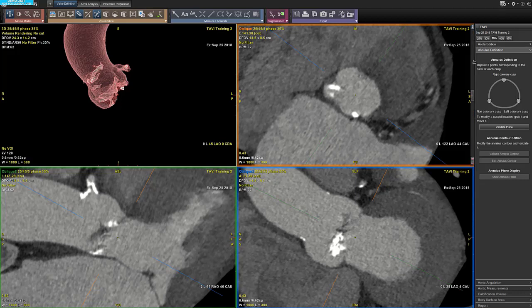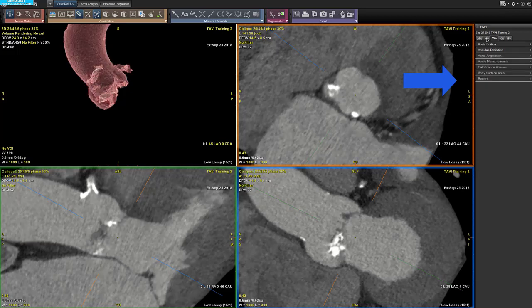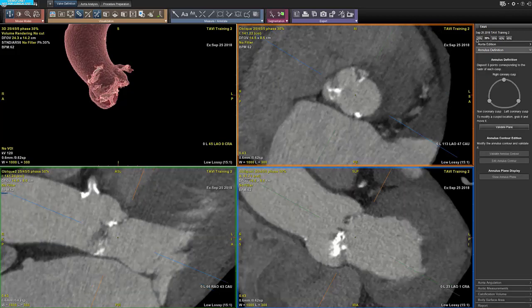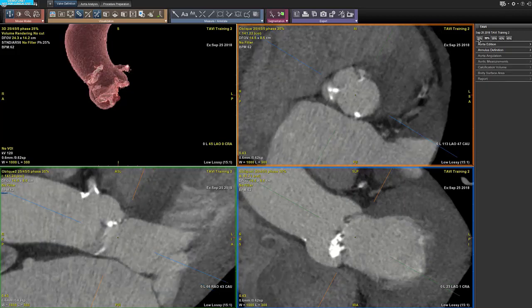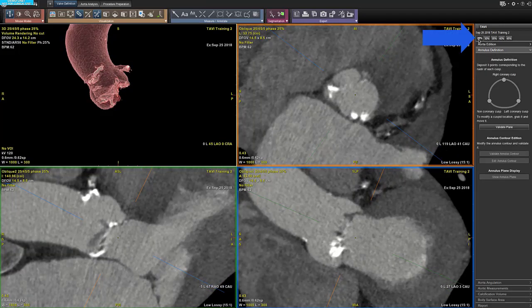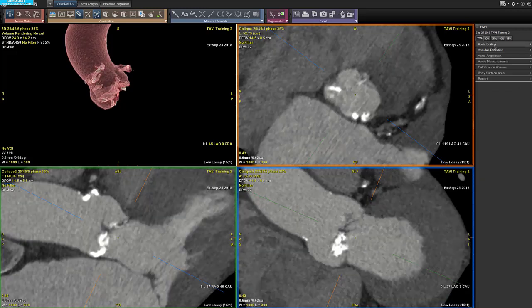Within the valve definition step, all the steps are displayed in accordion on the wizard panel on the right hand side of the screen. The first step is at the top and the following ones at the bottom. On the wizard panel, there are tabs for each phase. You can easily navigate from one phase to another by clicking on the phase tabs.